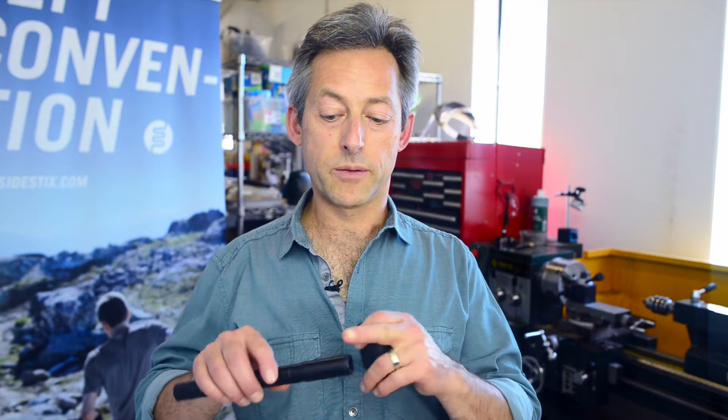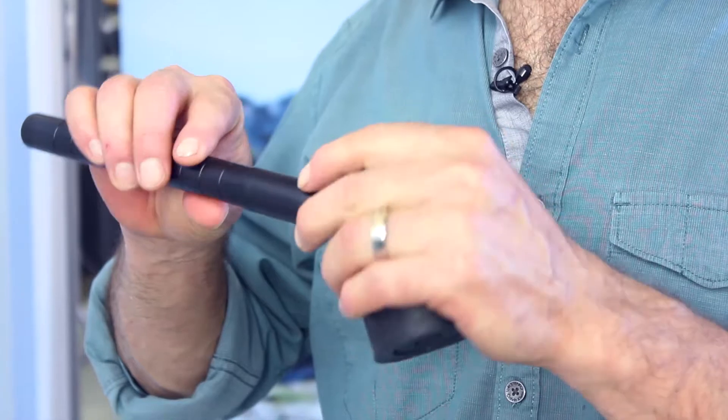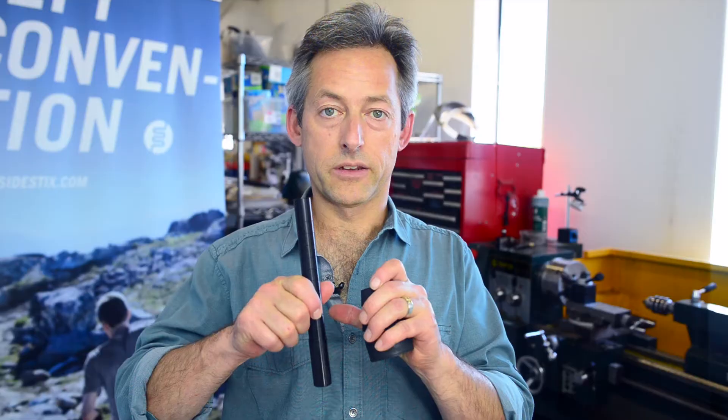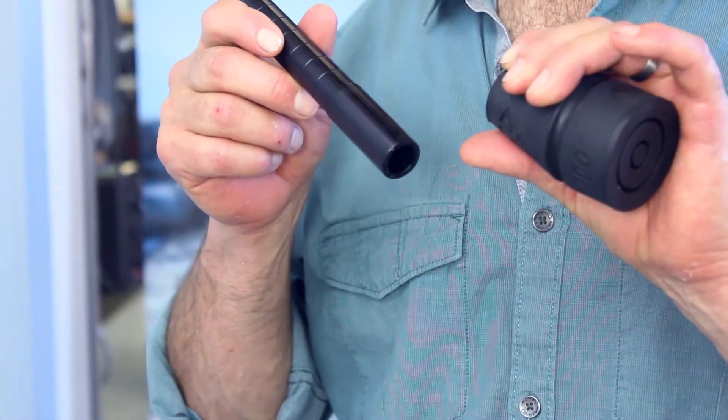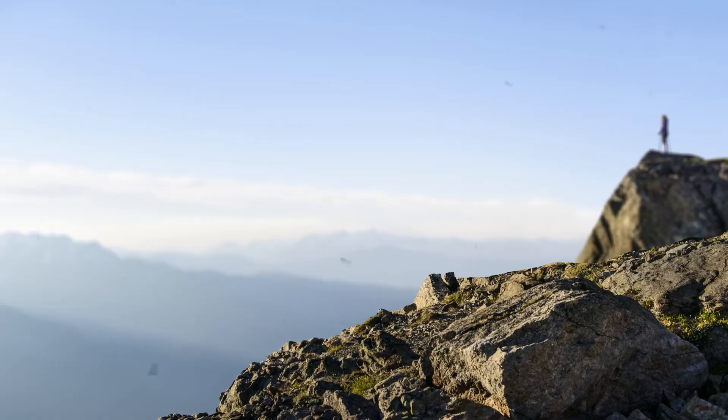When it comes to putting the tip adapter back into the rubber tip, to make it a little bit easier, we recommend just getting a little bit of water, maybe just dipping it in a cup on the end and then popping that in and you'll find it will slip in much, much more easily. And as soon as the water dries, it won't come off anymore.